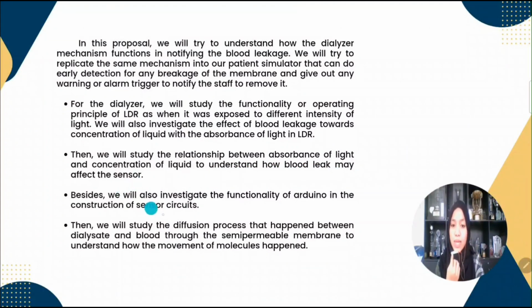Third, we will also investigate the functionality of Arduino in the construction of sensor circuits. Fourth, we will study the diffusion process that happens between dialysate and blood through the semi-permeable membrane to understand how the movement of molecules happens.